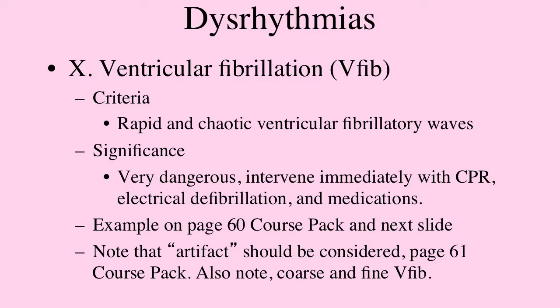If you look on page 60, this is an example that we saw earlier. At the top is an example of VFib, but then the one toward the bottom, middle bottom, was a live example where you had the R-on-T phenomenon. The person went right into VFib. We stopped the treadmill. We started CPR. I was right there for this, and we got help coming in and started to work with that person who was on the ground and had a blood pressure of 0 over 0. So you can see a couple of examples there. Pretty easy to see, but again, very dangerous.